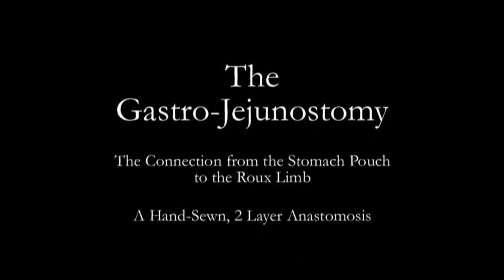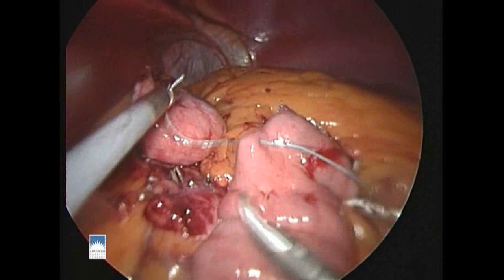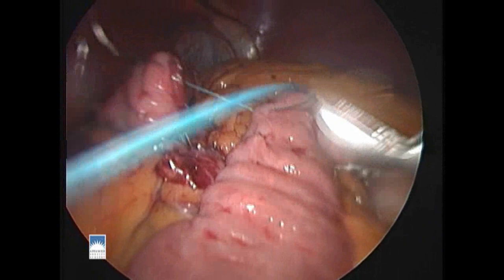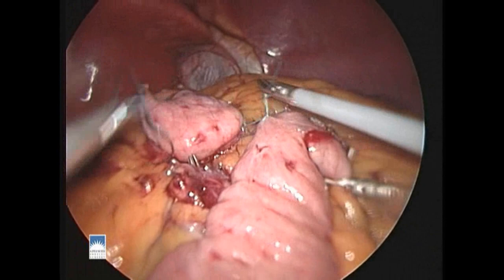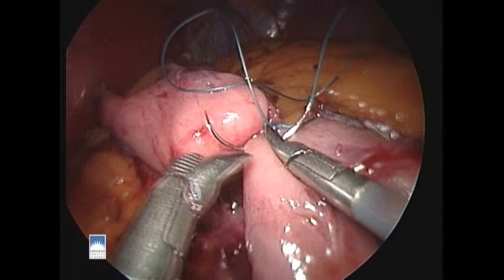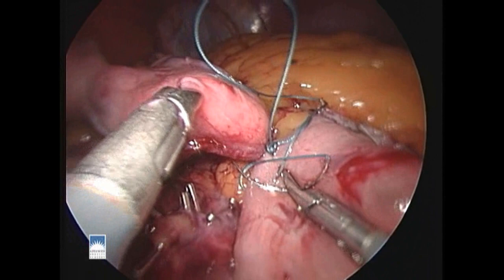Now we're ready to make the connection between the new stomach pouch and the Roux limb of bowel. With the Roux limb adjacent to the new stomach pouch, we begin with a suture to connect the two tissues. The communication between the Roux limb and the stomach pouch will be made with suture in two layers — one around the outside layer and another around the inner layer. A sutured anastomosis of this kind affords excellent protection against bleeding and leaks, as well as becoming tight or strictured in the future.